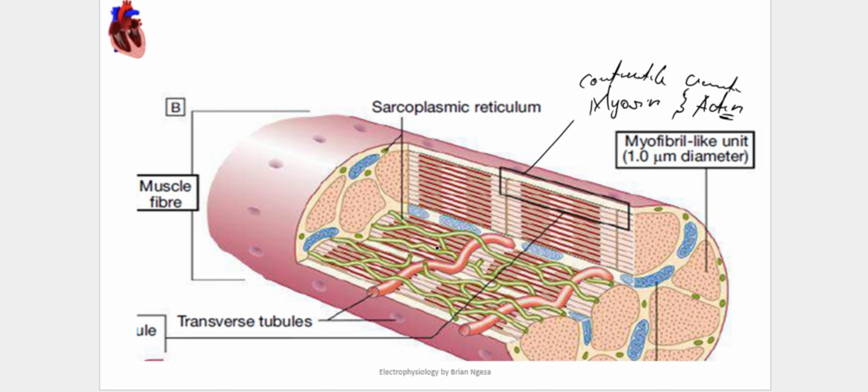So in covering the ECG, what we are insinuating is the muscle is only able to contract as a result of electrical energy.